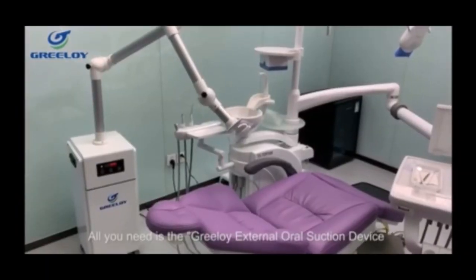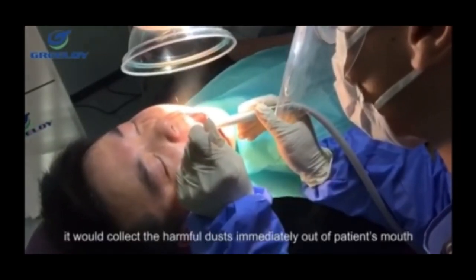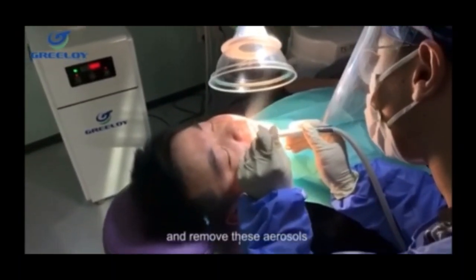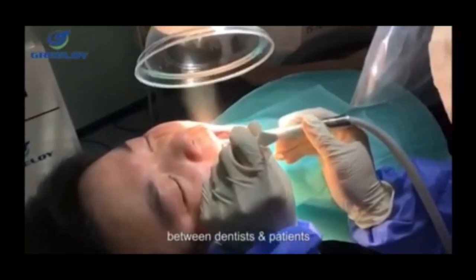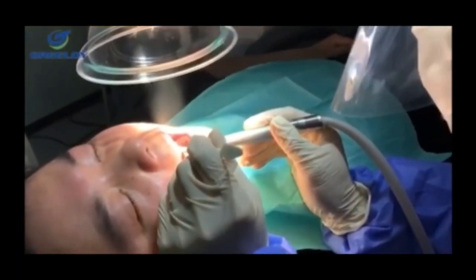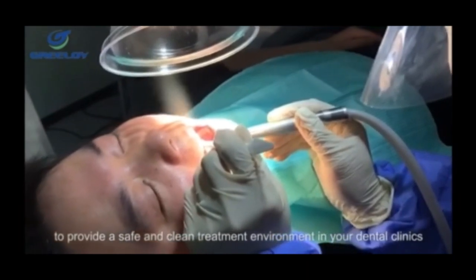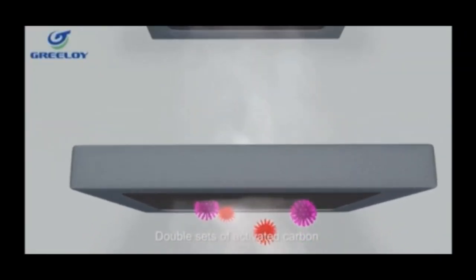All you need is the Greeloy external oral suction device. It will collect the harmful dust immediately out of the patient's mouth and remove these aerosols to prevent cross-infection between dentists and patients, to provide a safe and clean treatment environment in your dental clinic.